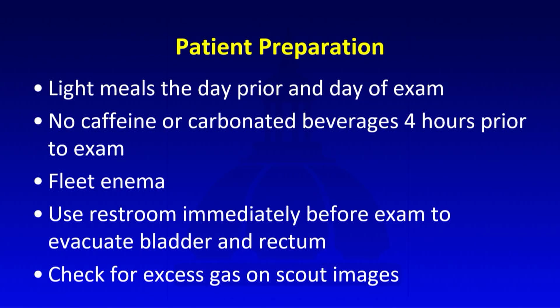And in terms of patient preparation, we recommend that they get light meals the day before and the day of the exam. No caffeine or carbonated beverages 4 hours before the exam. If they have a morning appointment, we recommend that they do a Fleet enema at home the night before. And then if they have an afternoon appointment, they should do the Fleet enema the morning of. But regardless, we recommend the patient use the restroom immediately before the exam to evacuate the bladder and the rectum.